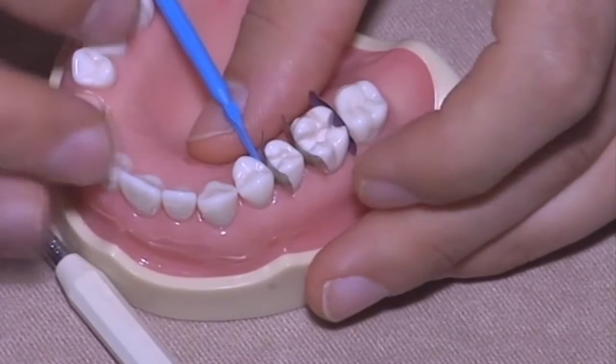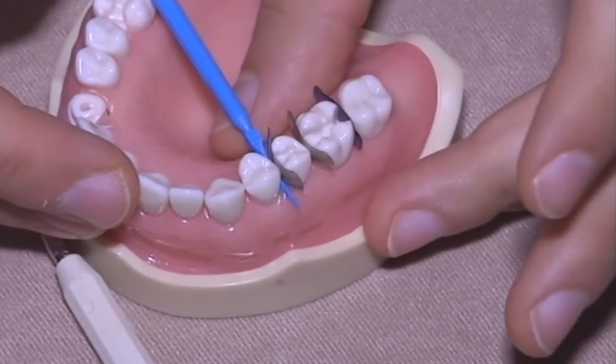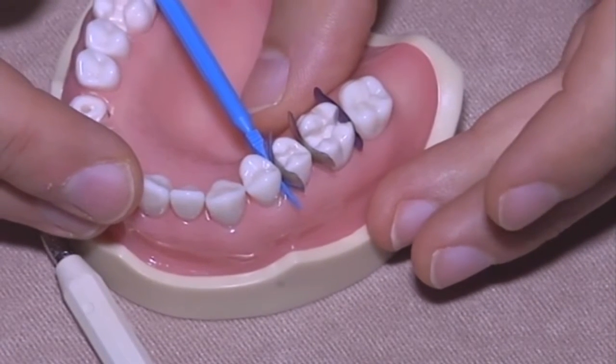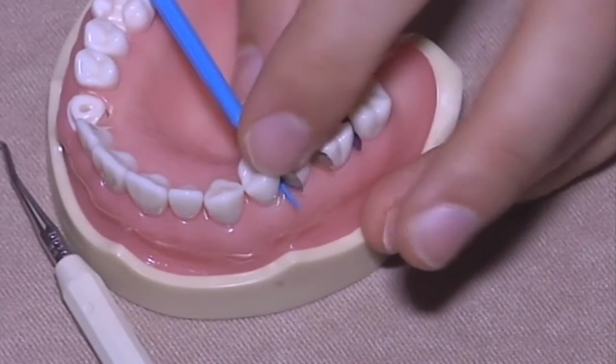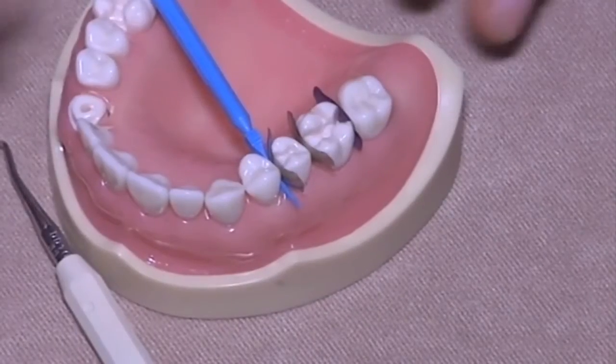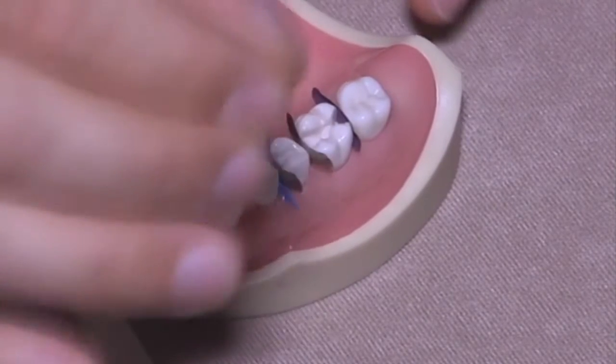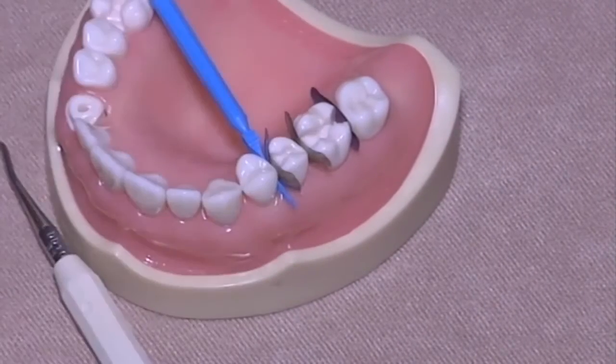So here I think that the blue one would be okay, and every time you place the wedge, you have to keep the matrix blocked with your finger or with your forceps or with an instrument. Otherwise, when you push, the wedge will push your matrix over.